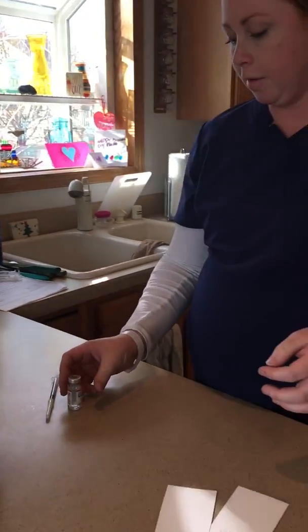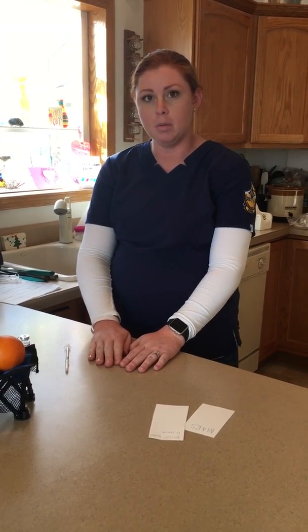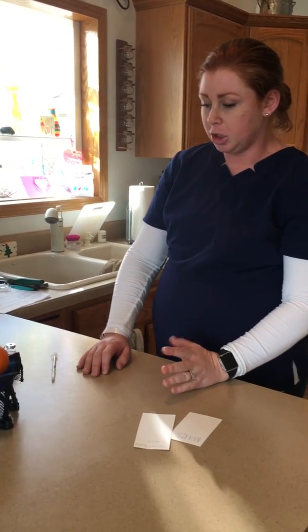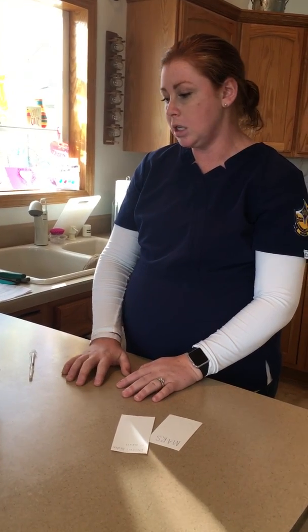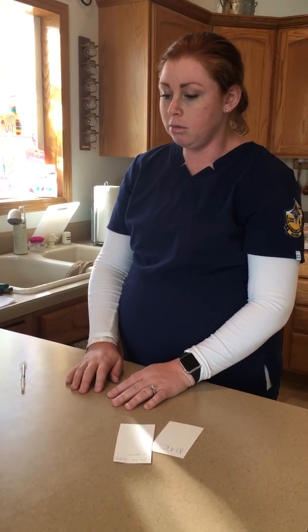After I get everything drawn up and ready to go, I can go back into my patient room and identify my patient with 2 identifiers, asking them their name and date of birth, and then verifying that with their medication record and their wristband. So I have the right patient. I'm going to explain the kind of test we're doing today. It's a TB test. I'm basically going to inject this medication right underneath the surface of your skin, and we're going to need to see you back in 48 hours to assess your reaction to this test.